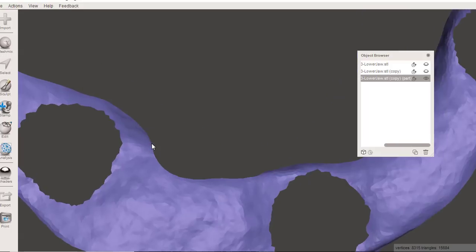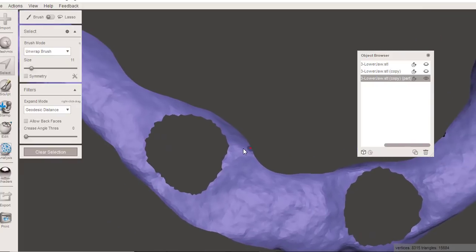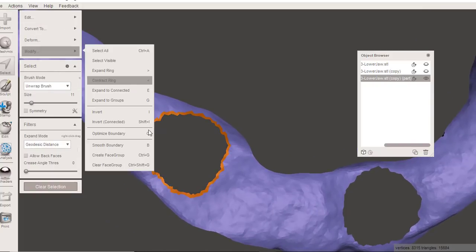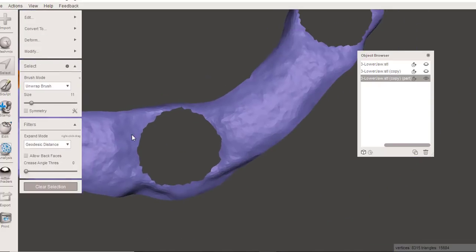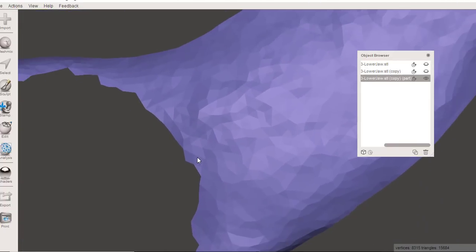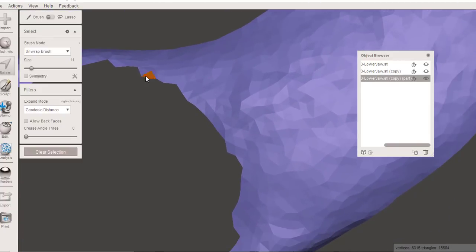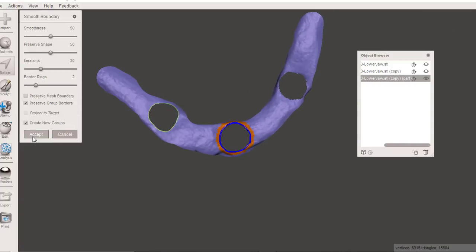So let's clear that. Select tool, go down to a really, really small spot size, and just come in here and select right on the edge. That's going to select that whole thing, and then you can smooth the boundary and accept it and repeat the process. You'll have to clear it first. Once again, select an individual triangle, smooth it, and accept it.